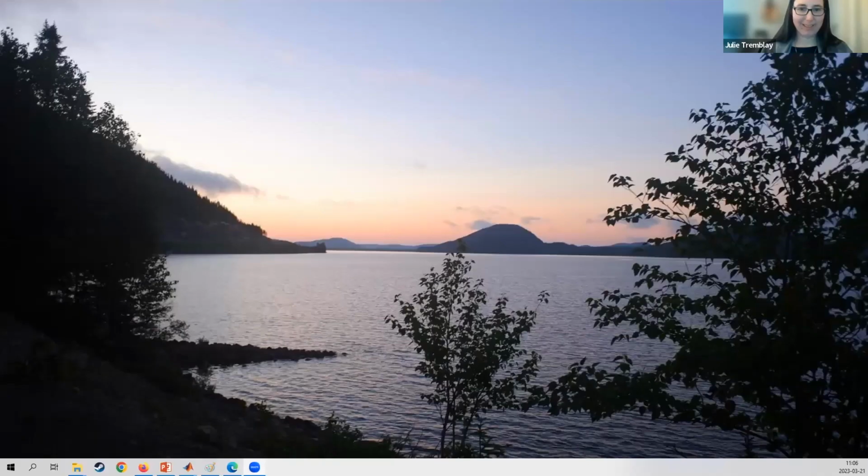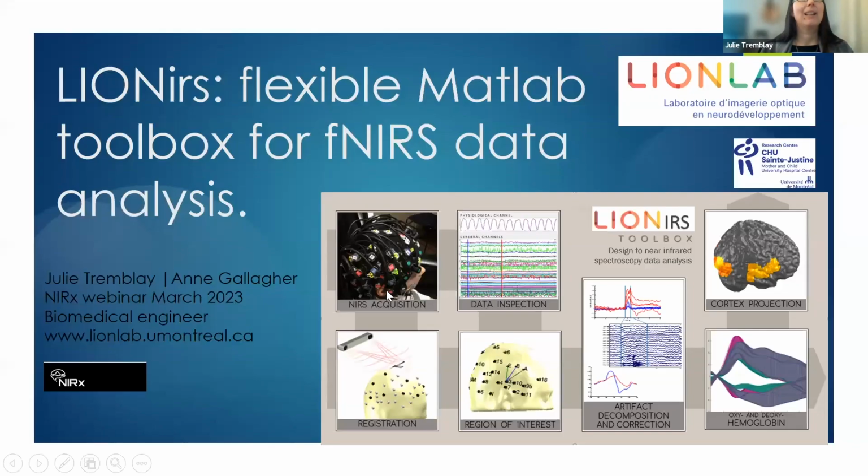Thank you very much for the introduction. I share my screen to present you the LIONirs Toolbox today. Thank you for inviting me to this webinar. It's a pleasure to present my work on the LIONirs Toolbox today. I'm working at St. Justine Pediatric Hospital, as Andrew told you.